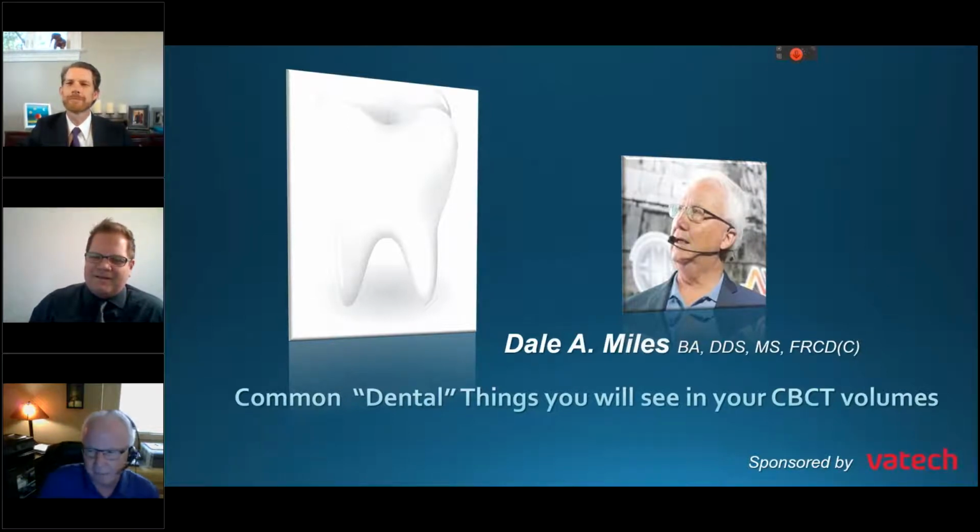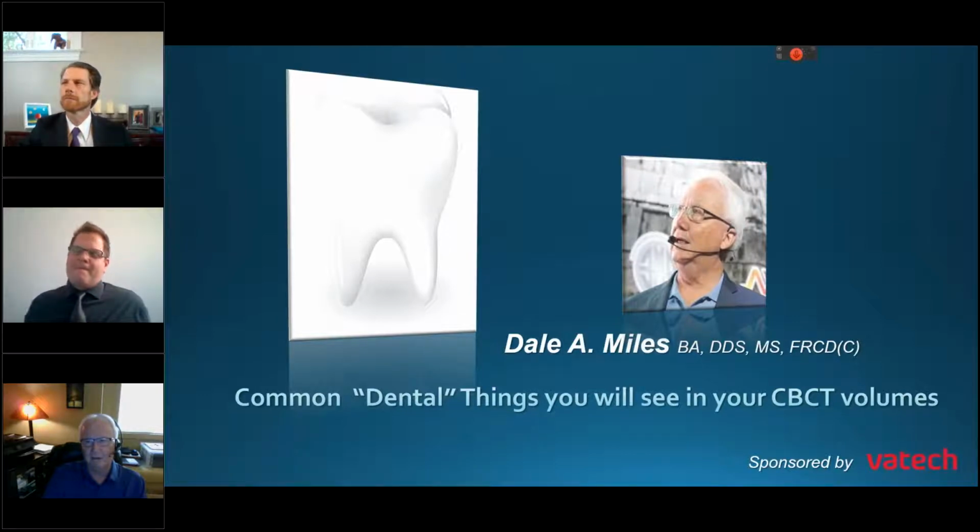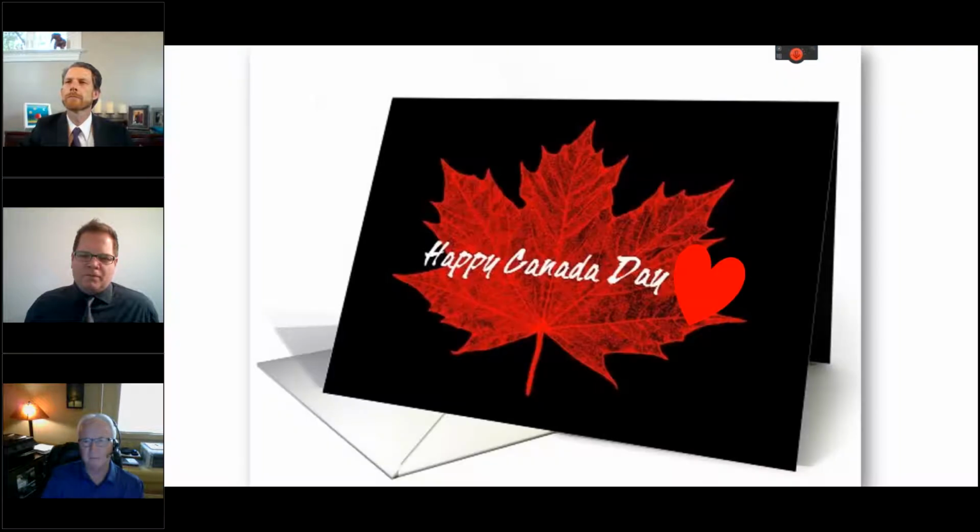I hope there are some people returning to this webinar series that saw the first couple of sessions. This is going to be a much different one in that we're going to talk about some very common things that you see. I get these questions, as do the people from Vatech, quite frequently. It always surprises me how much we forget after we leave our dental programs. And then when things pop up in our traditional imaging or our CBCT volumes, we kind of forget what we were taught. So hopefully this will be a good refresher.